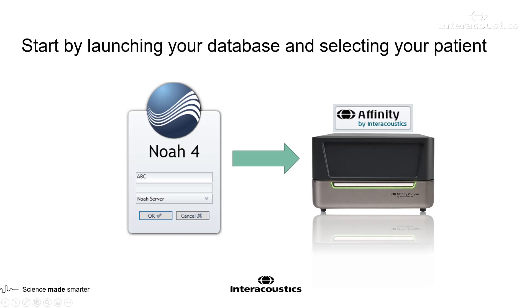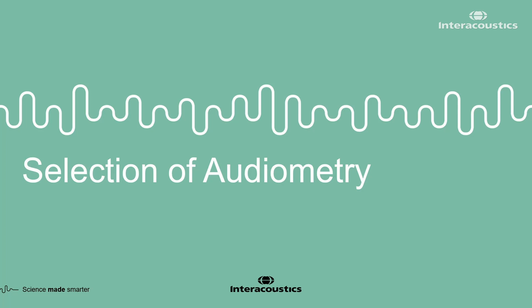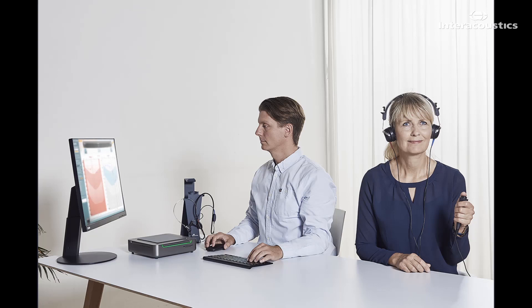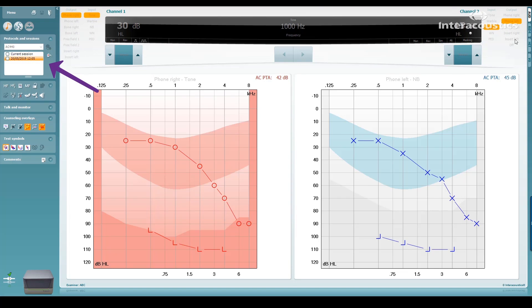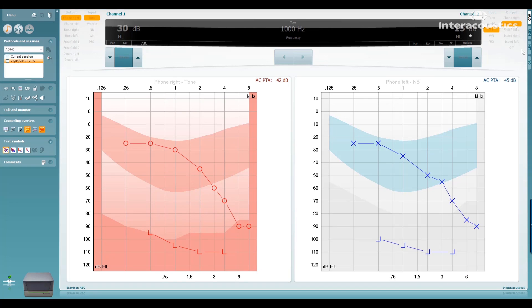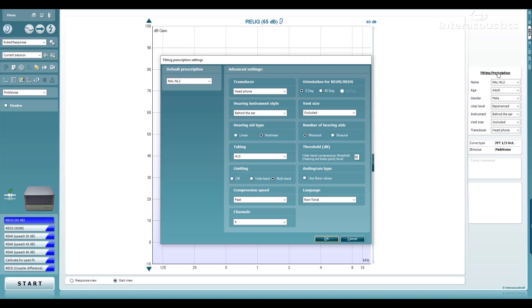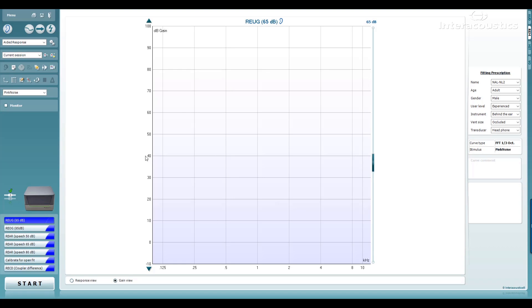In your patient management system, select the patient you wish to fit hearing aids for and launch your Affinity Suite software. Your software will start up in the audiometry screen, and your audiometry is your starting point for hearing aid fitting. It should be performed to the best detail to ensure the best fitting and reduce returns from your patients. You can choose to perform the audiometry from scratch or select the audiometry session you wish to base your fitting on. On launching the REM module and selecting your test protocol, you'll be prompted to select the fitting prescription. We recommend choosing NAL or DSL algorithms, as these are both evidence-based targets which give a good starting point for your fitting.